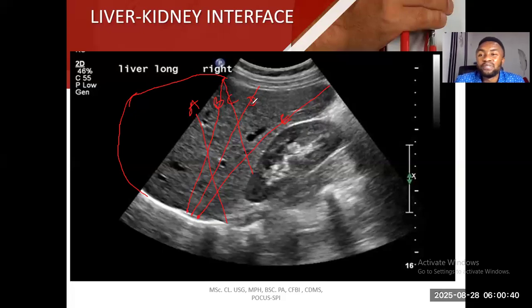Which may not be too wrong, because the difference between the E and the D is not that significant, though of course it can add up to increase the measurement. Do you understand? So if you do it the E way, then it's fine, so that you get the accurate measurement. Okay.